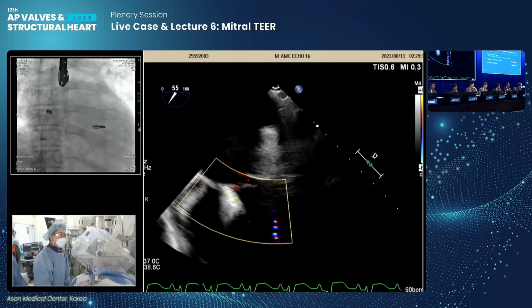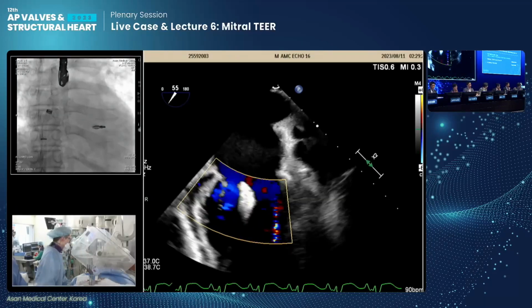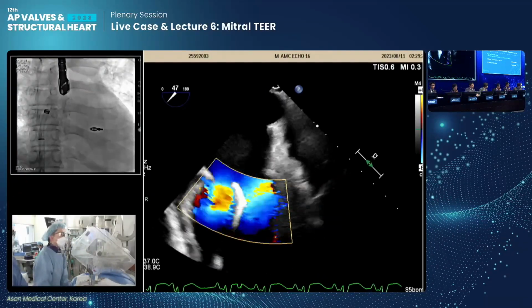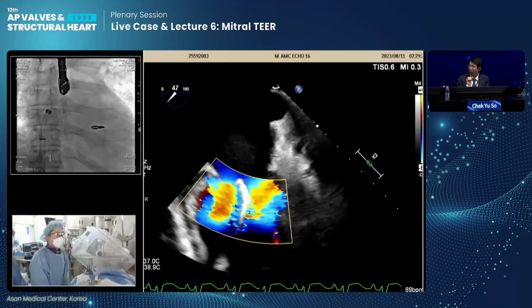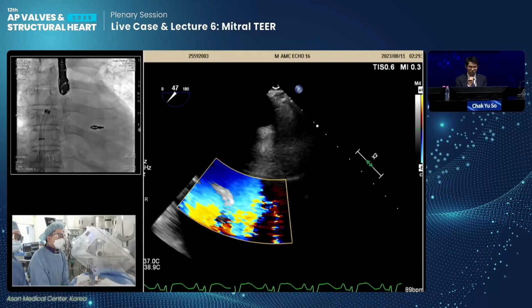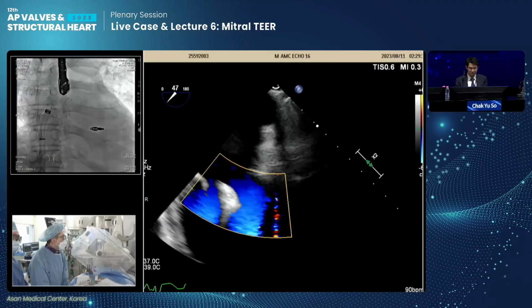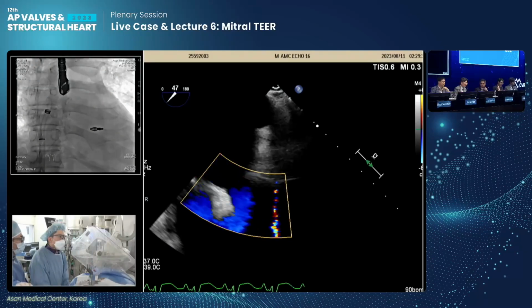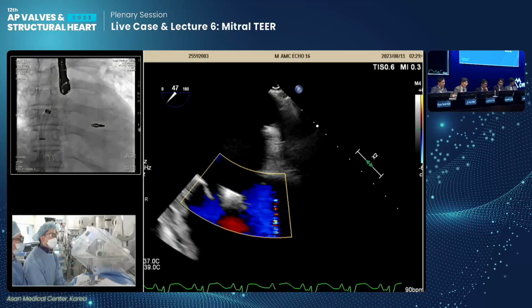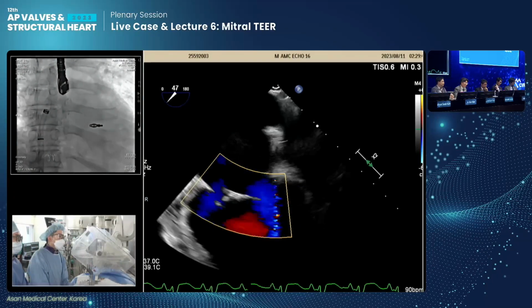And I think in treating ventricular functional mitral regurgitation, complete elimination is not a must, because you want to improve the forward flow and also allow more room for guideline-directed medical therapy. So this is a very excellent result. I think there is some controversy, because if we increase the blood pressure and add more medical therapy, then we can decrease the MR, but we are not sure.